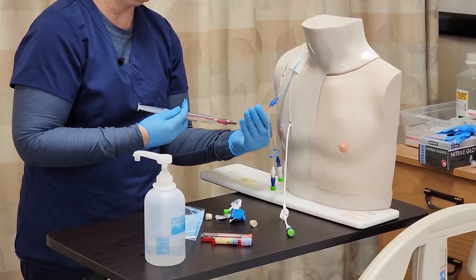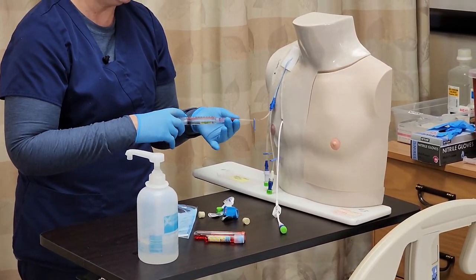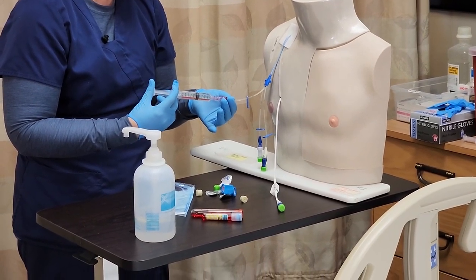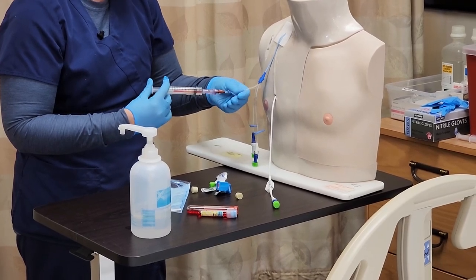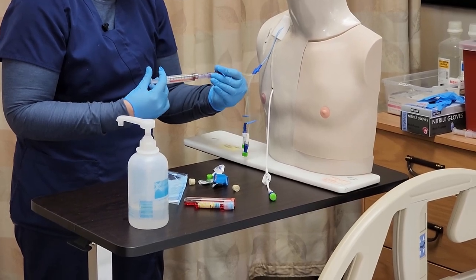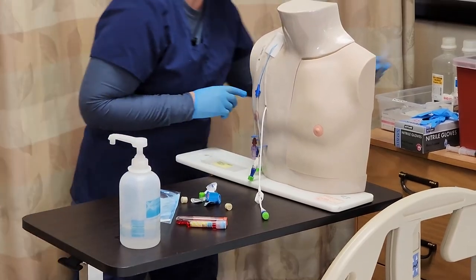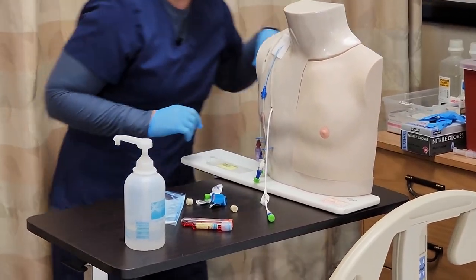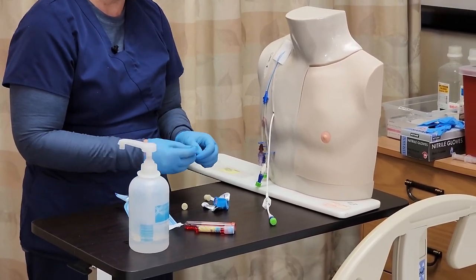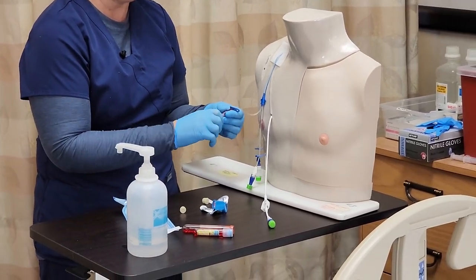I attach my saline, unclamp, and flush with the recommended amount per policy. Then I clamp again and discard that syringe. I then take a new disinfectant cap and place it on the end of my needleless connector.